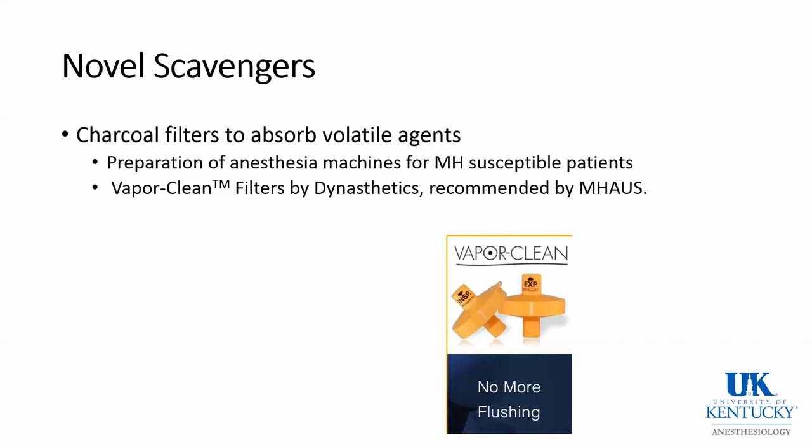The Vapor Clean filter by Dynesthetics is recommended by MHAUS. I show you an image from their website. These filters apparently come in pairs. These ones are now orange. It appears that the filters that we have at the University of Kentucky are still gray. I think there's been a color modification.